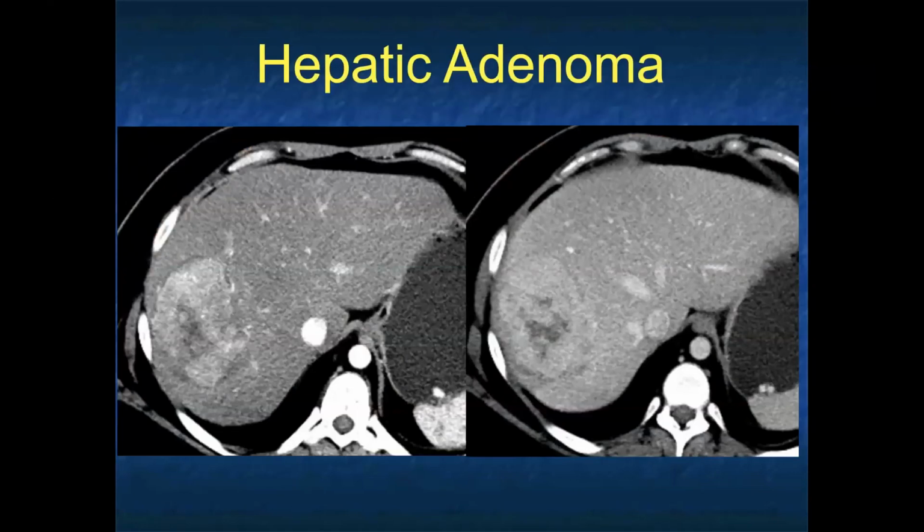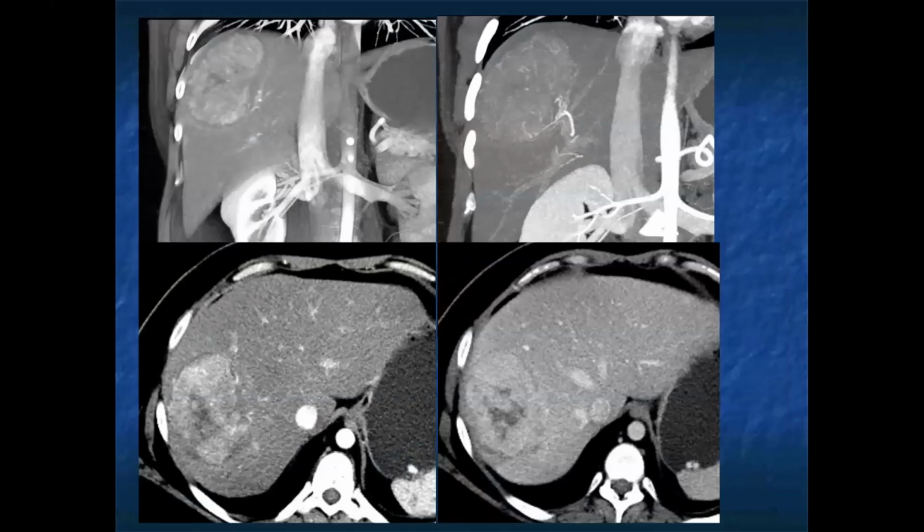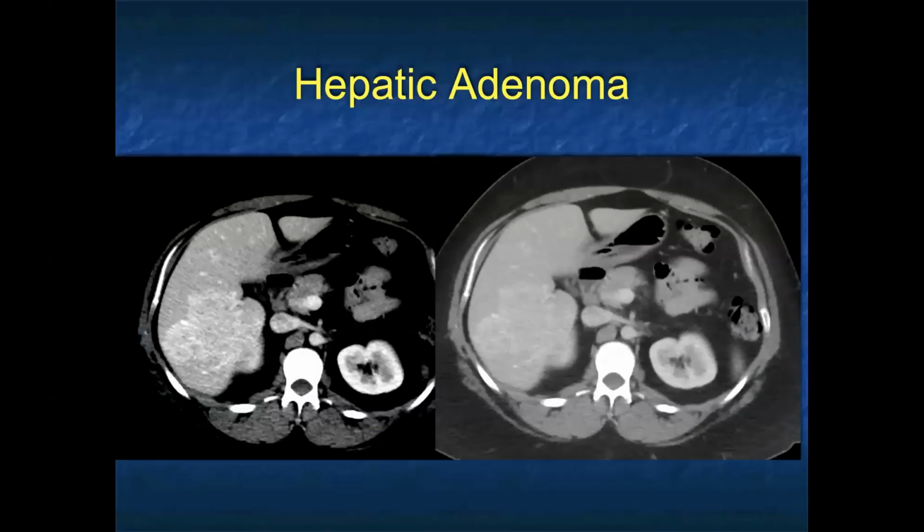Another example here, vascular lesion, central necrosis. Again, I'm thinking about hepatoma. This was resected. It was hepatic adenoma. So there is this great overlap between the two. Typically, the issue that helps you, it's female, it's younger. We often think about things like fibrolamellar hepatomas as younger females.